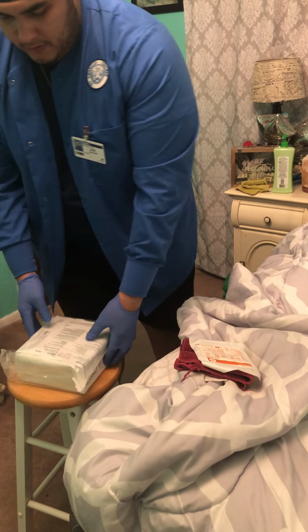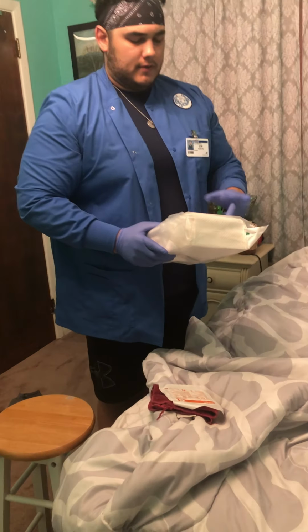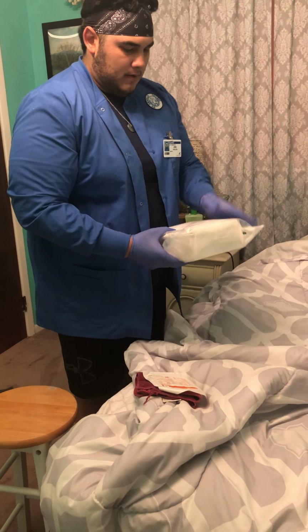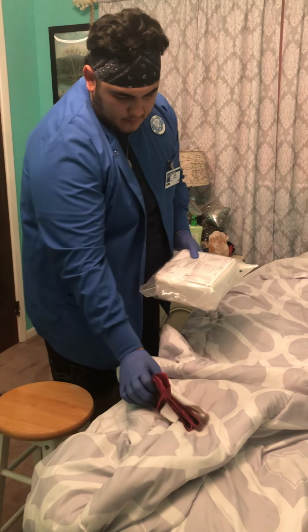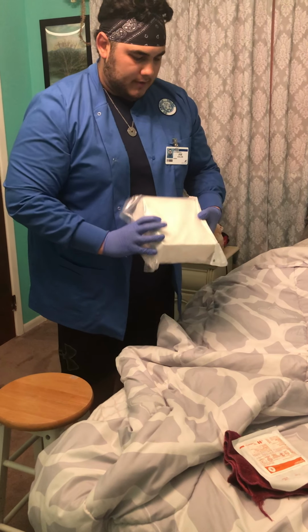Alright, and so before you open a sterile kit, you always want to examine it just to make sure that it hasn't been opened or there's any tears or anything that's going to make it not sterile anymore. So we're going to go ahead and open this now.